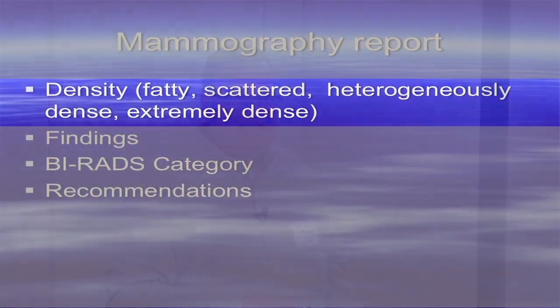So the report, how many people have actually read mammography reports? Oh, very good. Hopefully it had all these categories because this is required by MQSA to be in every report. The density of the breast tissue. How many people are familiar with that phenomenon where you have to inform the lay public of the density of their mammogram? I know it's required in California. It's becoming more and more common elsewhere. It's a standard part of every report, and the only thing that's changed is you have to notify the patient of what their density is.